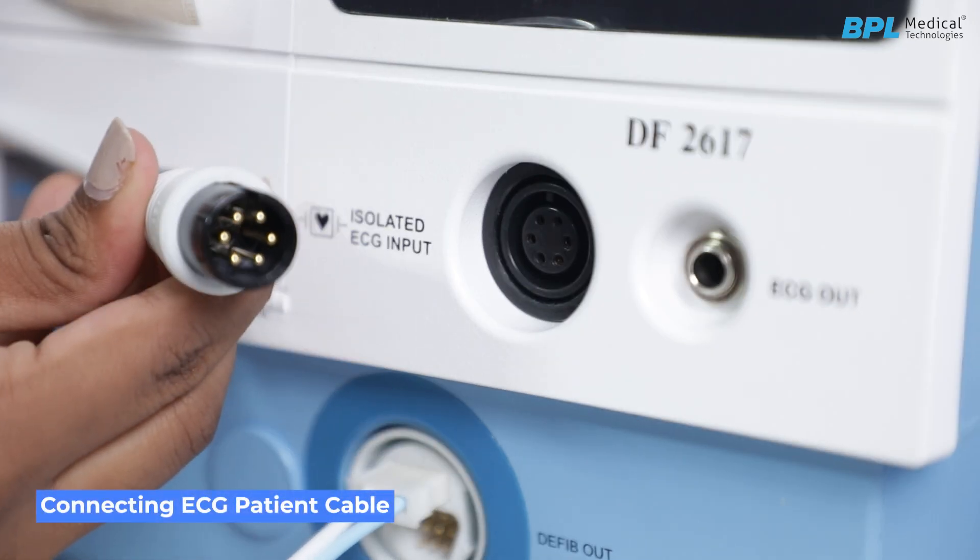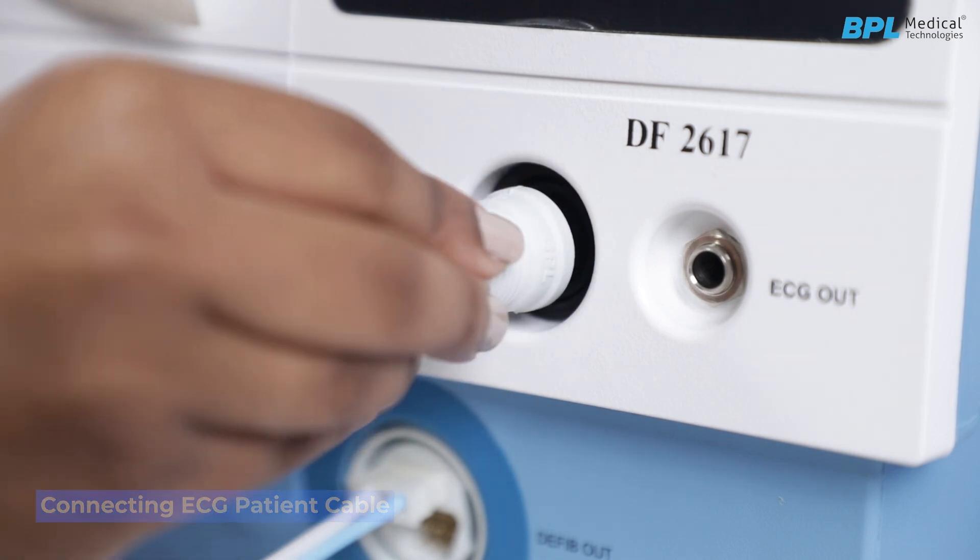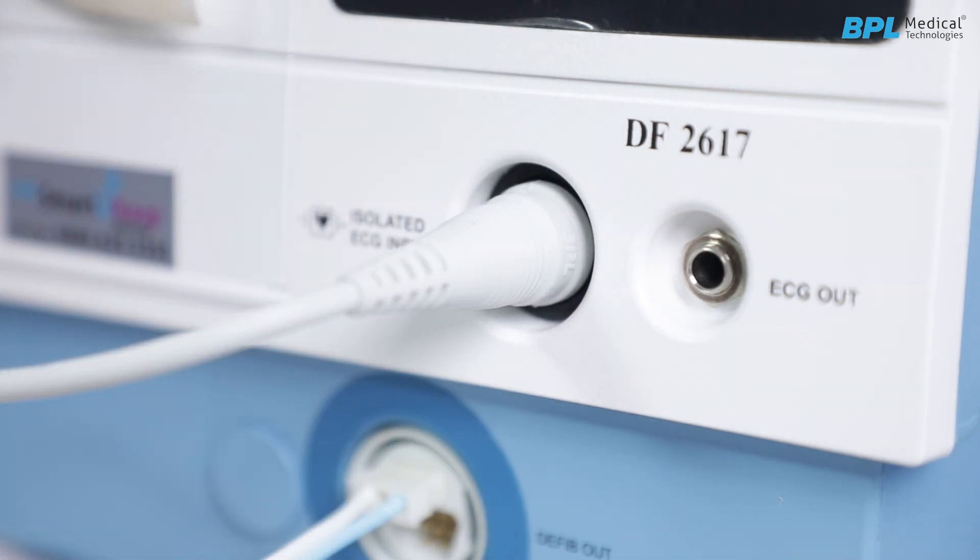Connecting the ECG patient cable: Connect the ECG patient cable plug into the ECG input connector on the front panel and push it in firmly.